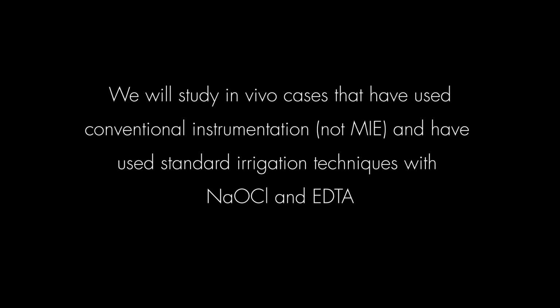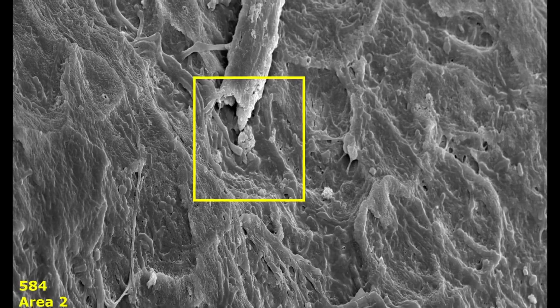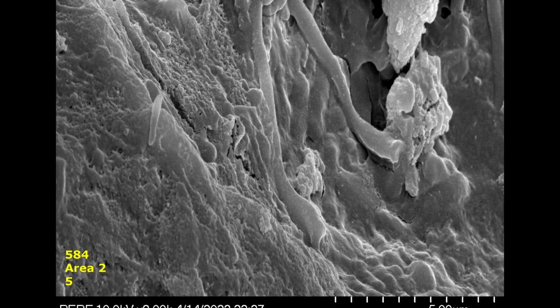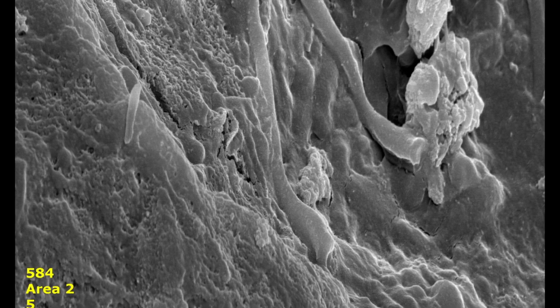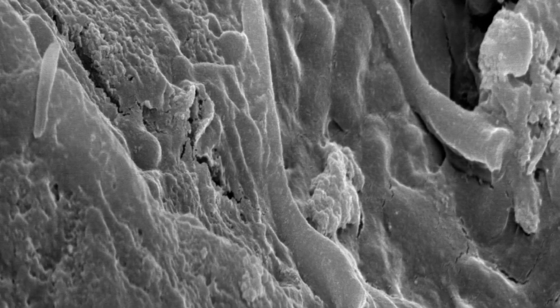Then we will study in vivo cases that have used conventional instrumentation and conventional irrigation techniques that Pushpak has sent me. He sent me 3 such cases. And when we go into those cases, this will also provide some context for you when we actually look at the enhanced irrigation, because you'll have something to compare to.